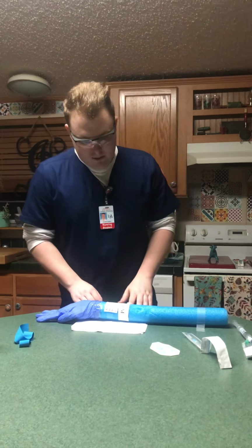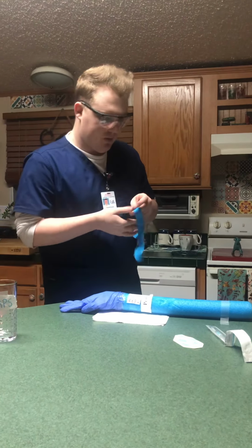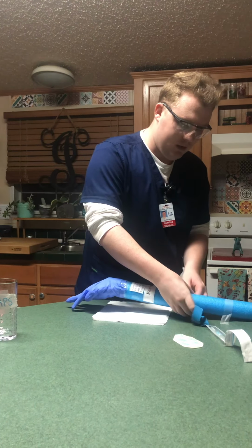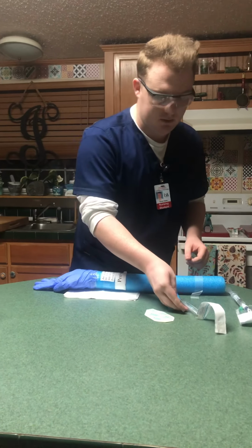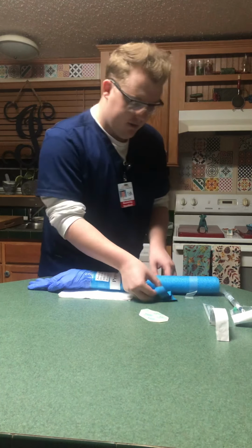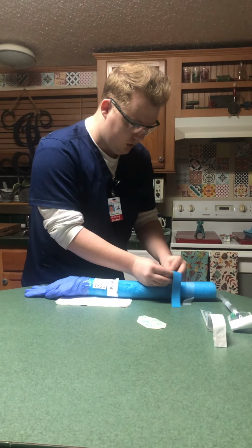So now I have my waterproof pad, and now that I've selected the vein that I want, I'm going to apply my tourniquet 4 to 6 inches above the site, and once I apply my tourniquet, I'm just going to move this over to the side, and I'm not touching the inside. After I apply my tourniquet 4 to 6 inches above, I'm also going to check the radial pulse.